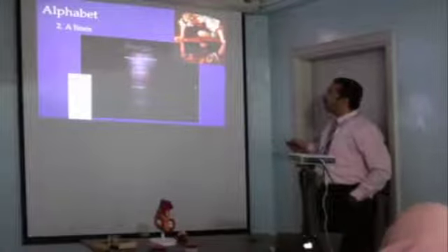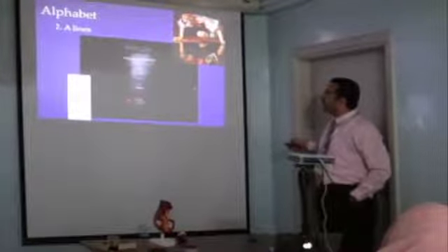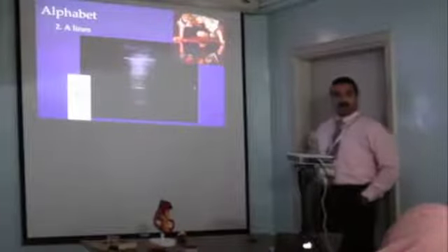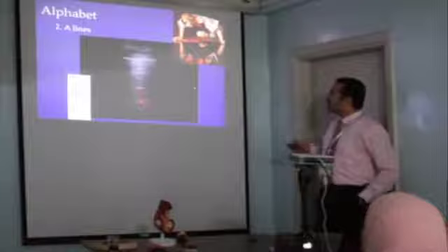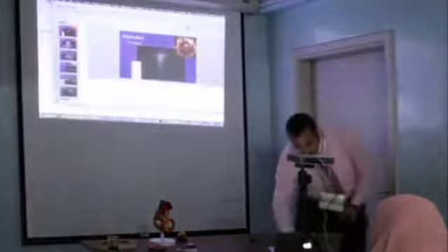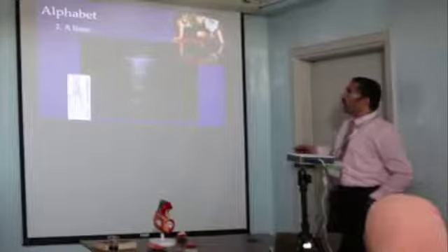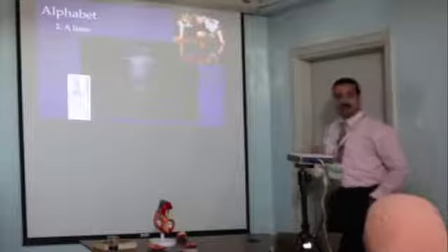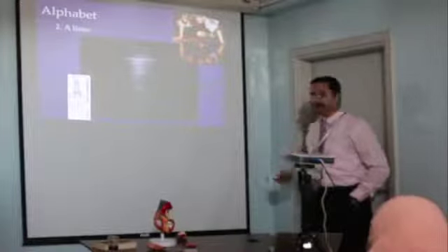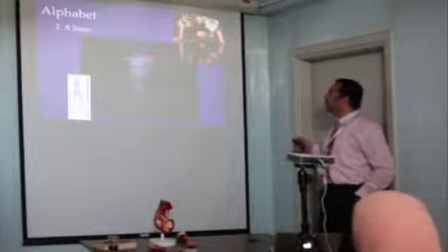So this is just a mirror image of the pleura at a different distance, another reflection of the pleura, and after more distance there is another reflection, so this is fainter than the first. The more you go with distance, the less quality of image you get, but it is at the same or almost the same distances. If you measure this one, we find it's the same here. So if I find this picture, this is A lines. It is just the mirror image of the pleura.